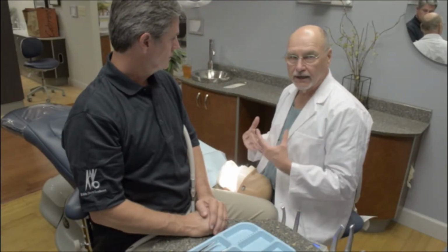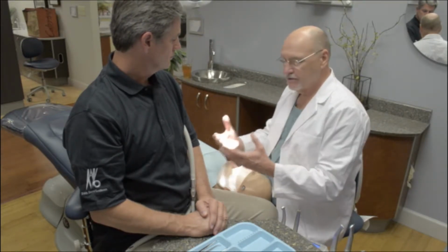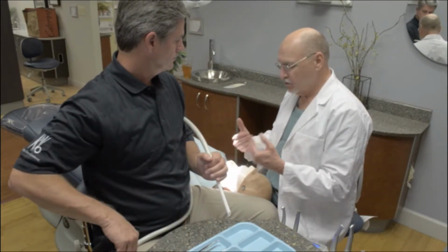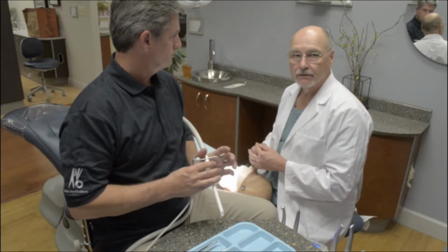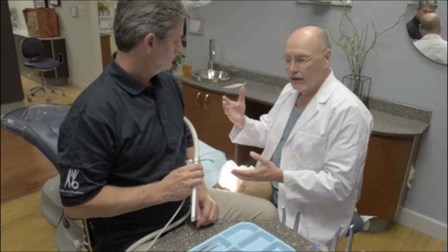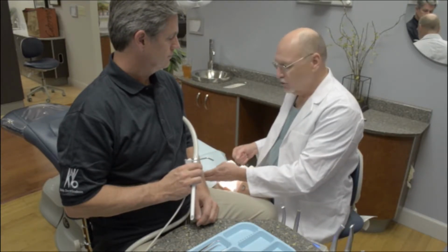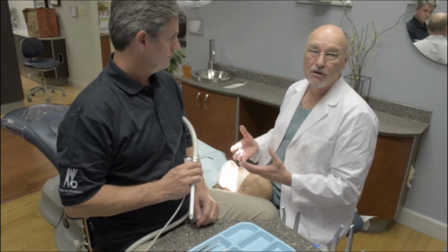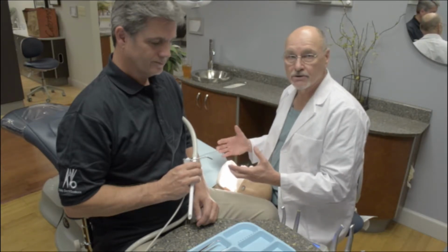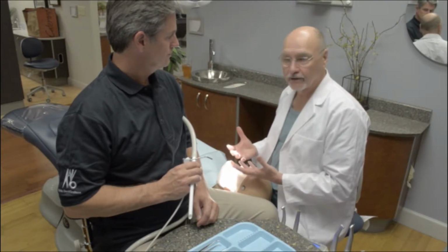After we've positioned the doctor, we've positioned the patient, we need to bring the assistant into the dental team and position the assistant so that they can ergonomically deliver instrumentation to the doctor. In order for this to happen, the assistant has to have some very specific coordinates, both horizontally and vertically. And you'll notice the assistant here has their left hip immediately adjacent to the left shoulder of the patient. And in fact, I call this a full contact sport of dentistry, because this is very, very close, tight quarters. Everybody's cramped here, but we're working on a very small area, which is the oral cavity.